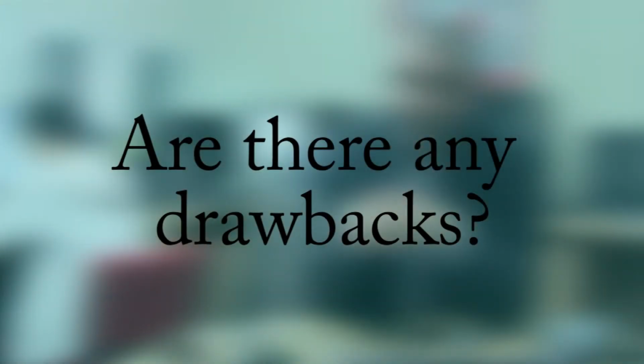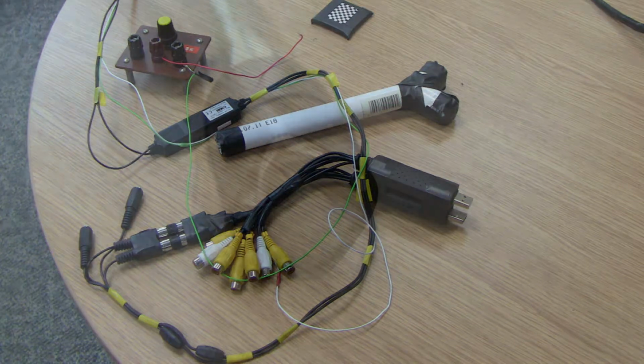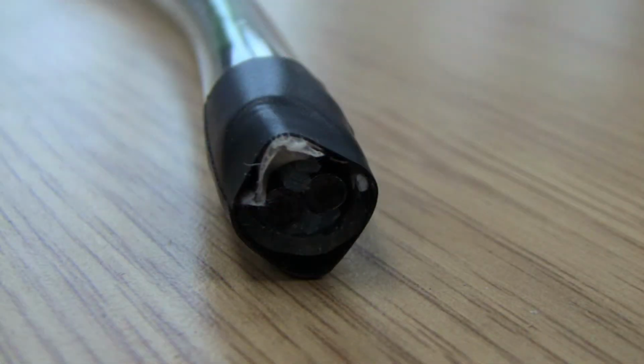Are there any drawbacks? Well, the system is more complex, so we need to use 2 cameras instead of 1. And also we need a 3D display to observe the environment. So the system in general is more expensive, more complex, and bigger. Even though there are drawbacks to the 3D endoscopes, the advantages significantly outweigh the disadvantages. There are still improvements to be made to the endoscope systems, and the drawbacks are slowly becoming fewer and fewer.